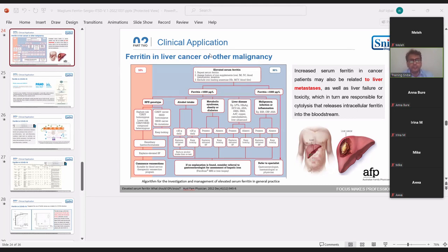So the IFU recommendation is 1 month, but practically keeping the reagent on board for 2 or 3 months is proven. But if you want to extend more, you have to keep the reagent on board only when patient samples are available.